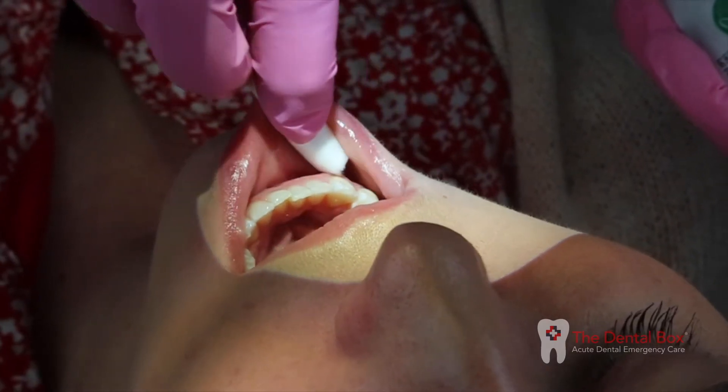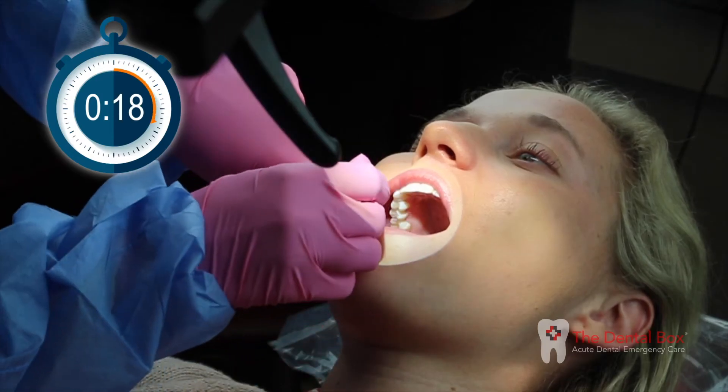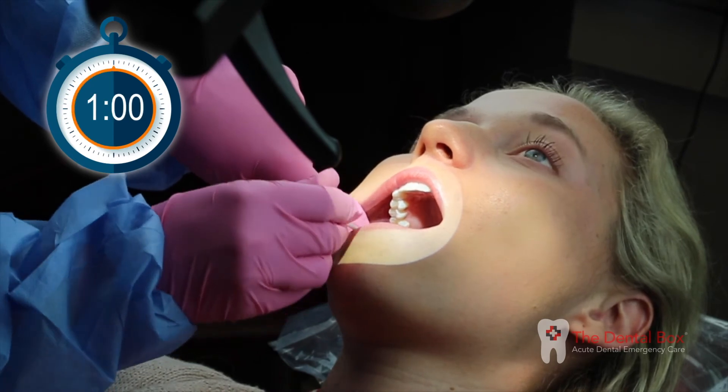Dry the area with gauze, then apply topical benzocaine gel for one minute.